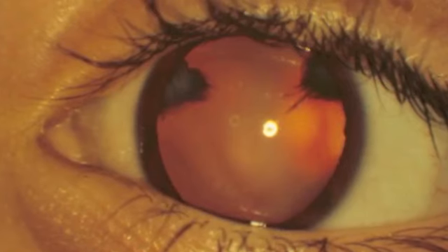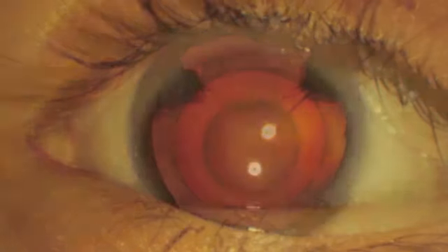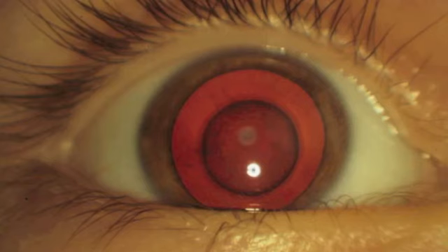Here is another child with cataract causing two black spots in the red reflex. Once again, a black circle within an otherwise normal red reflex represents a cataract. Never ignore a black red reflex. This should always prompt an ophthalmic referral.